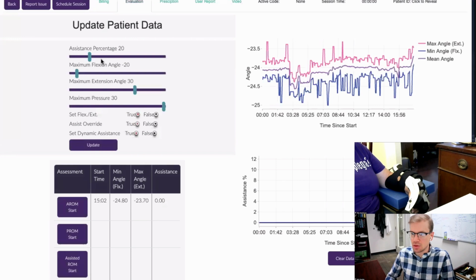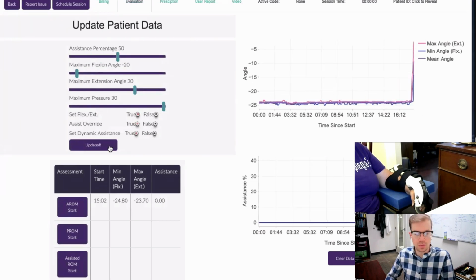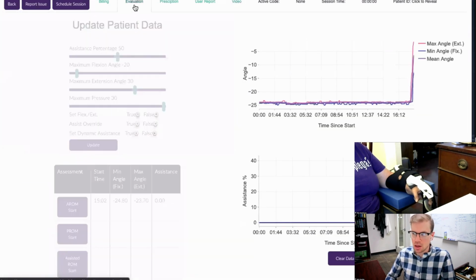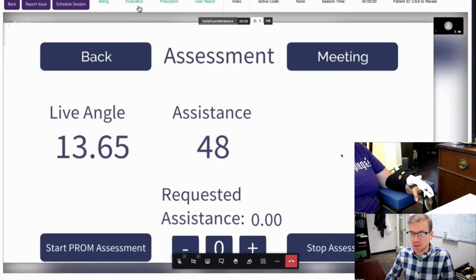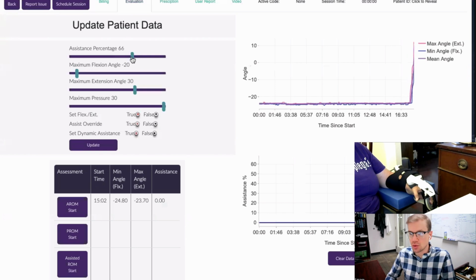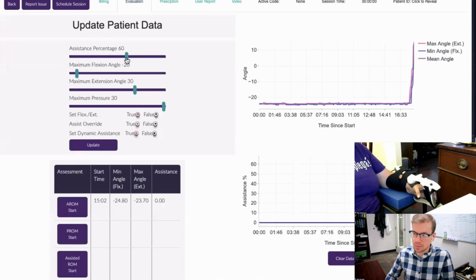So let me know as soon as you feel anything there. And this will also help me tell where we may have some intact sensations, because there are differences in the different actual sensory end organs that do various things in our muscles and our skin. So Paul, are you still with me there? I am. Very good.